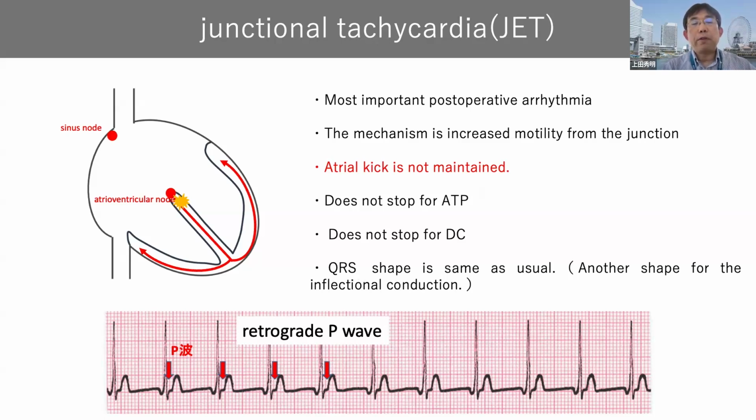So we can never dismiss it. We have to keep in mind that this can happen at any time after the Fontan operation, and as soon as possible, if we find those abnormal findings, we should go for further treatment.